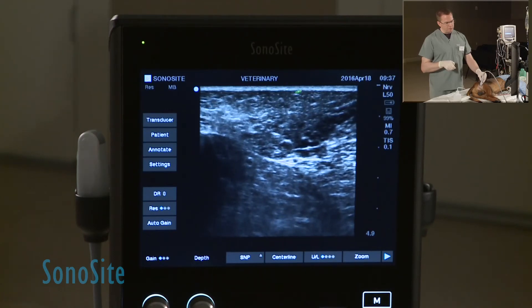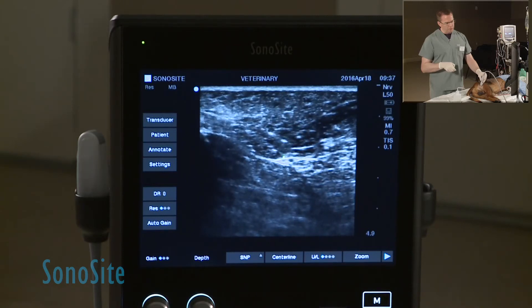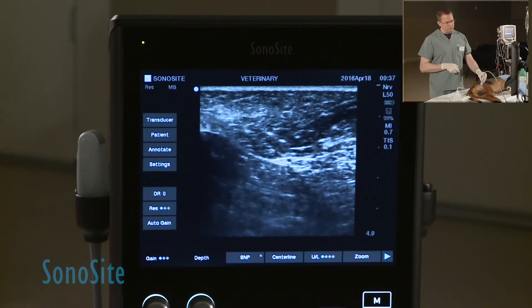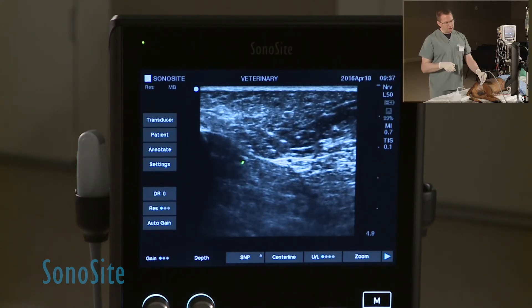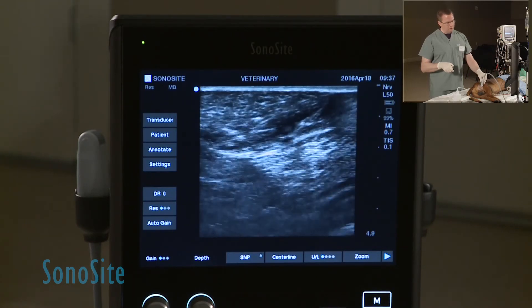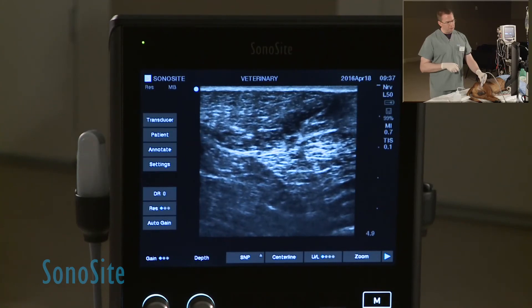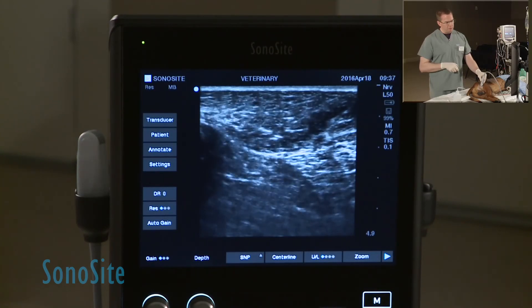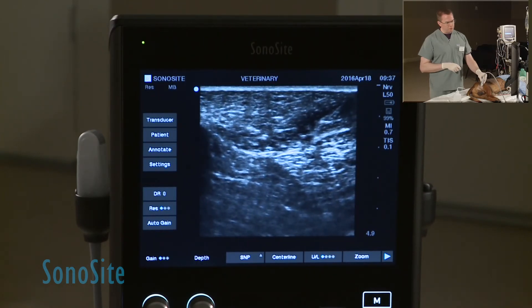Here is the skin surface where the transducer is being applied to the patient. At the deepest part underneath the biceps femoris is where we look for that very obvious structure — the sciatic nerve. Deep to that structure are the adductor muscles, and as we move caudally we get into an area where the semitendinosus and semimembranosus muscles are located. The target here is this really obvious little structure with the two circle components.